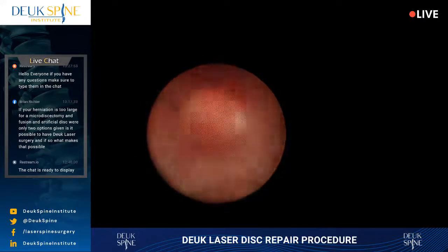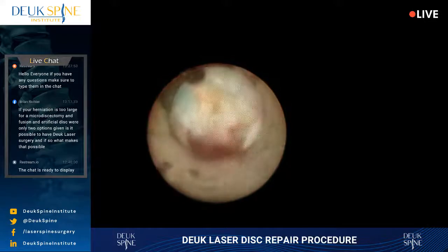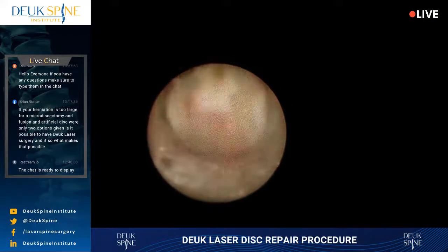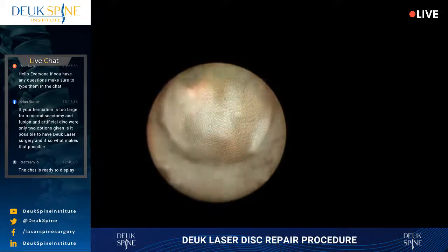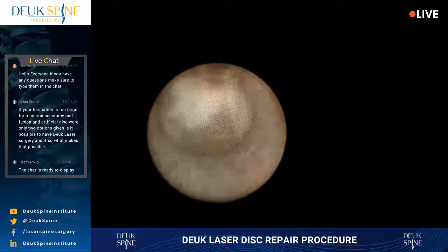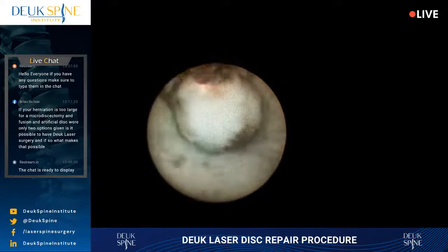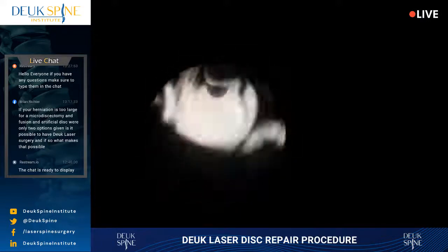All right, let's see here. So the laser fiber is half a millimeter, 0.5 millimeters, okay? I think it's going to come out in just a minute. It looks like it wants to come out. It is moving and shaking. Look at that thing. It's huge. All right, I think I can get it now.